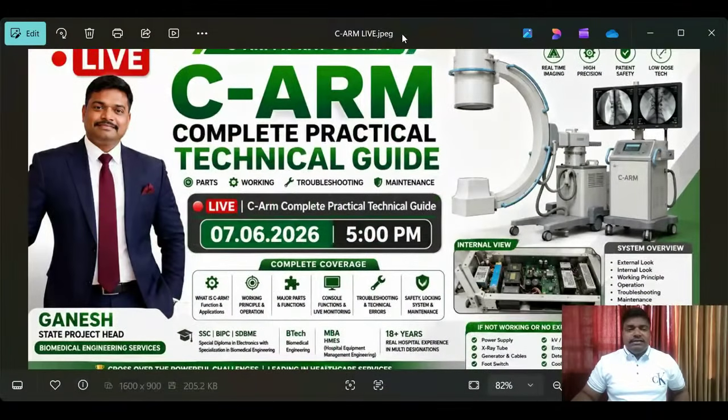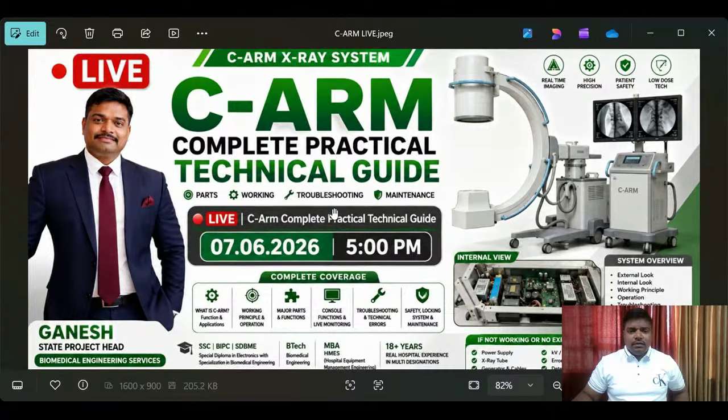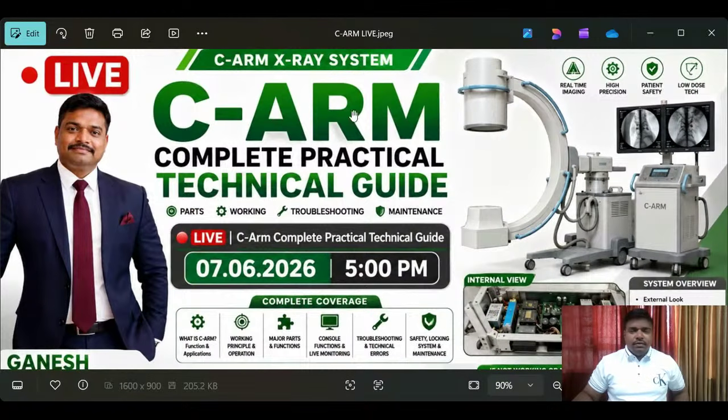Okay, right, I will show you. Now I'm ready to show you. Please try to engage and give me comments. And see, everything is going to be recorded, nothing to worry about. Whoever is not able to join today, it is Sunday. Is it visible? Yes, it is visible.